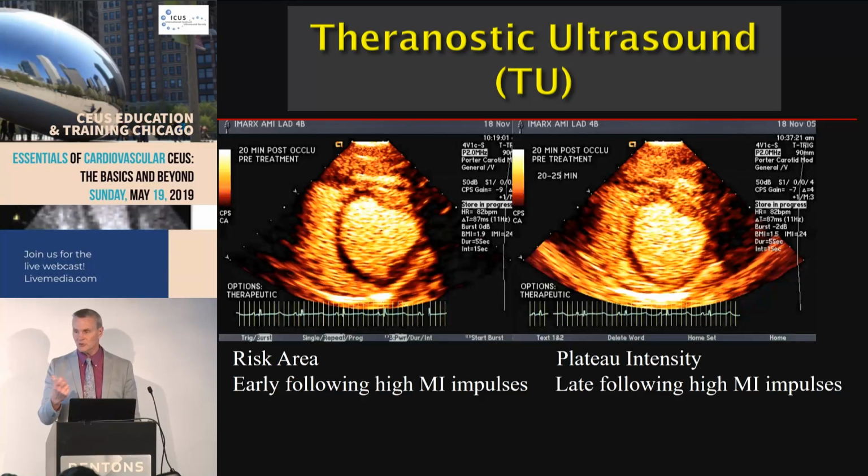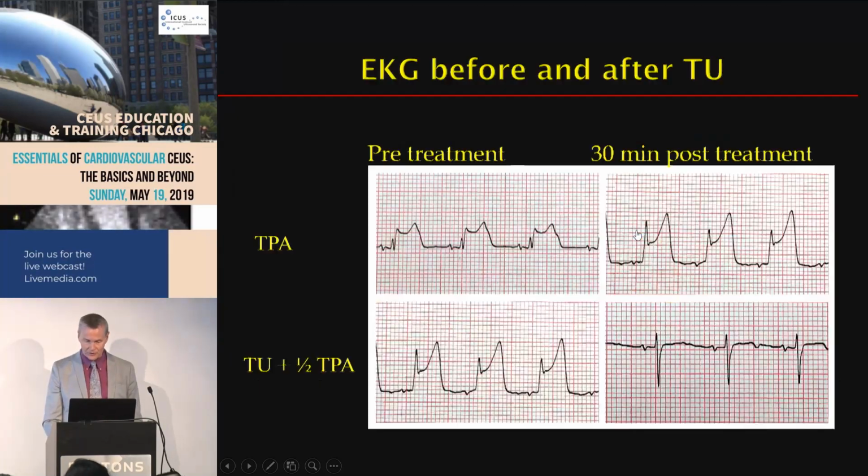Well, unfortunately, with transthoracic imaging, that's not really possible unless you have microbubbles present. Microbubbles lower the cavitation threshold. We're able to induce that inertial cavitation, and a consequence of it seems to be that a nitric oxide-mediated increase in myocardial blood flow is occurring.